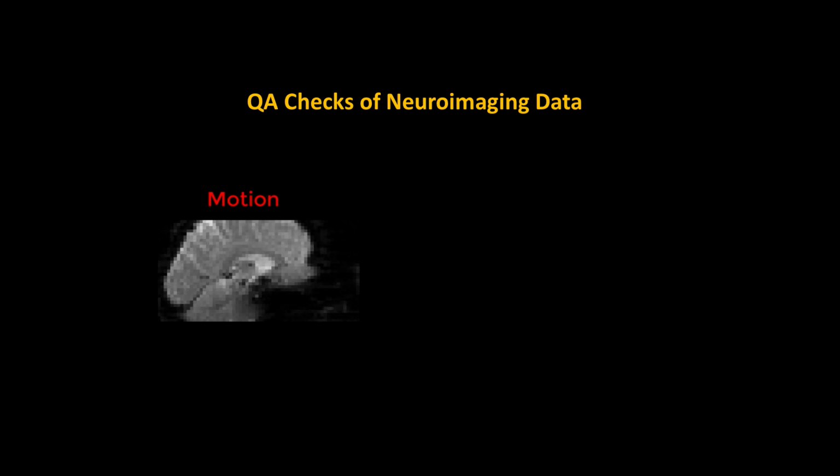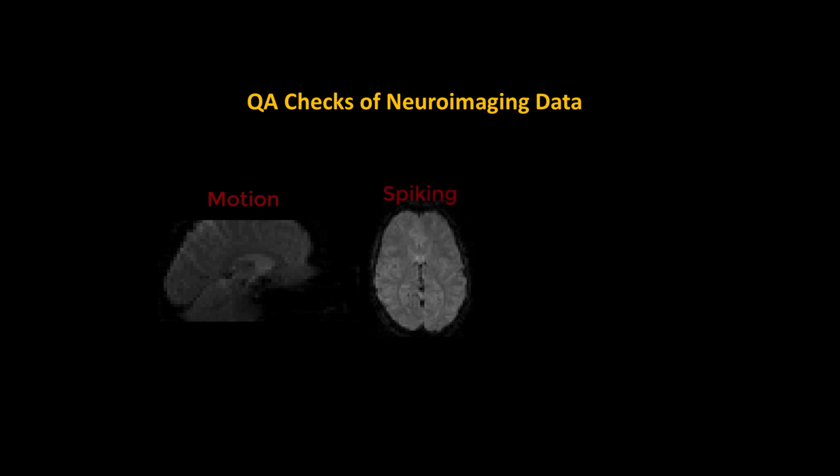Now we can do some pre-processing to remove small motion artifacts and set thresholds for how much motion we can tolerate before we either remove just that volume or possibly remove the entire run. They're particularly problematic with resting state data, and although we have tools for mitigating some of the effects, they can still make your data unrecoverable in some cases.